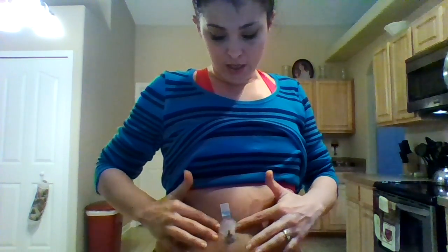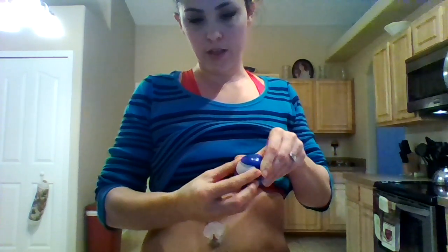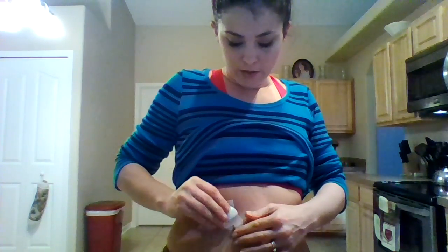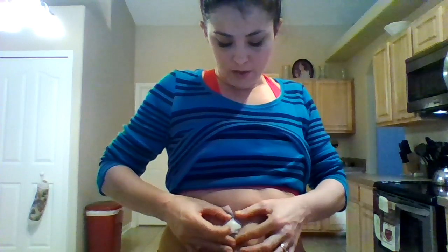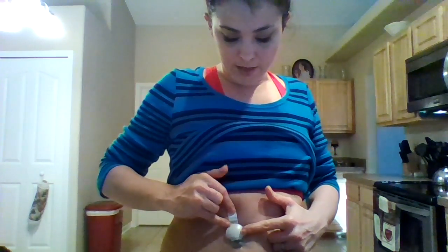Now it's time for the handy dandy transmitter. The transmitter is just this seashell looking thing. I'm pulling it out of the charger right now. This is the charger. This is the transmitter. There's the little hole, which is going to hook to the top of the sensor. So what we do is just plug that in. You hear a little click, and now we wait to see. There should be a green light that's going to start blinking up here. Well, do it.